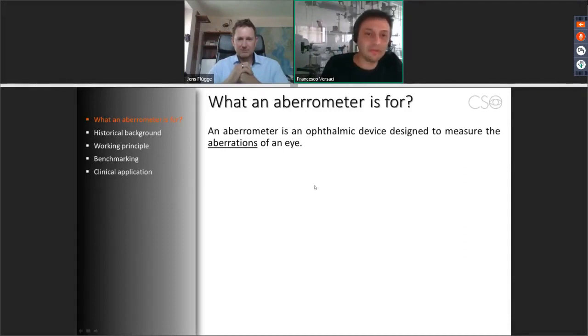So maybe we have to start from the beginning, talking about its working principle. During the presentation I will also provide some comparison with the devices that are on the market, and last but not least, we will look at some clinical applications and review some interesting cases together.